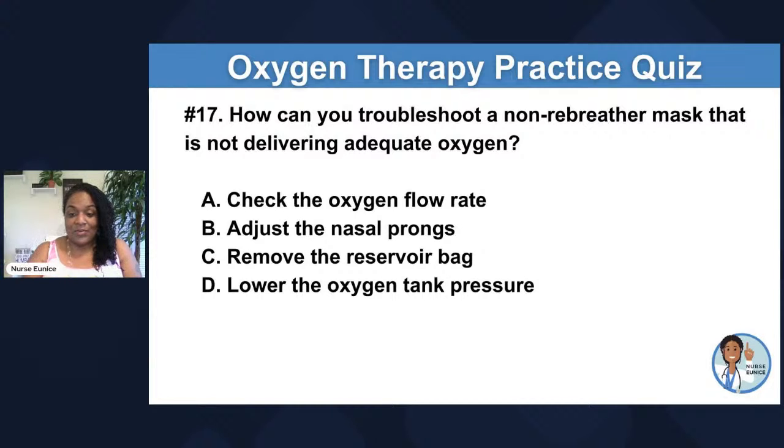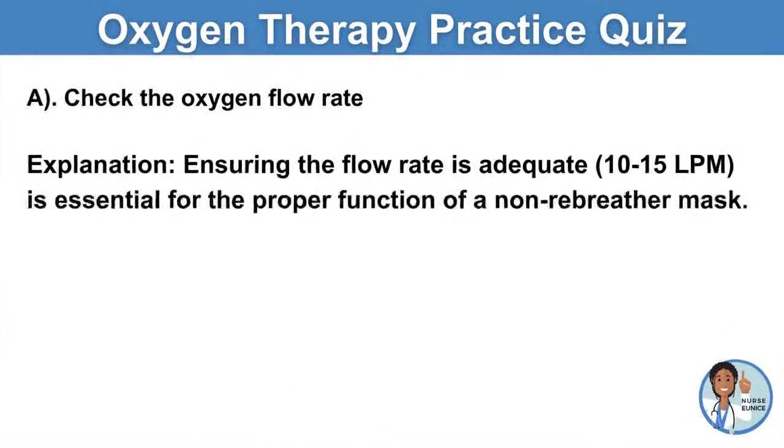And I'm revealing the correct answer. Target. And 3, 2, and 1. Yes, you all, you don't ever want to remove the reservoir bag. The reservoir bag should be filled with oxygen.